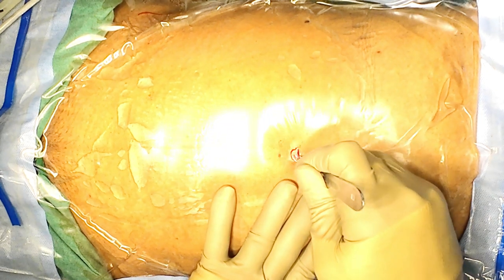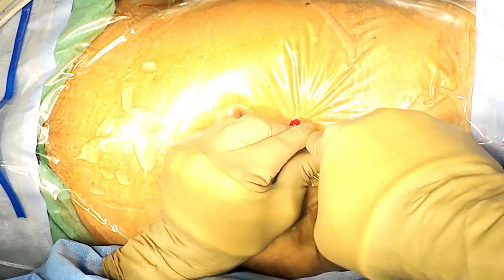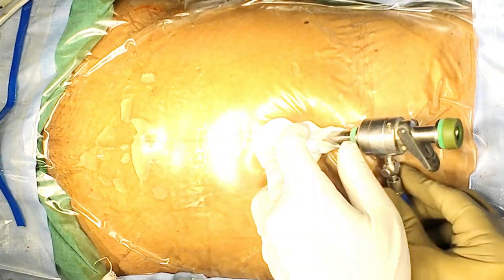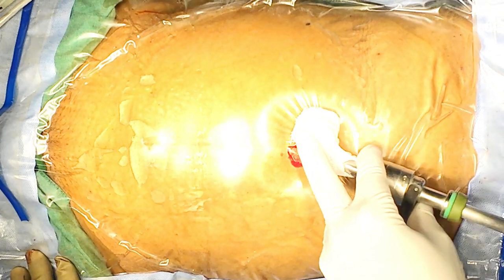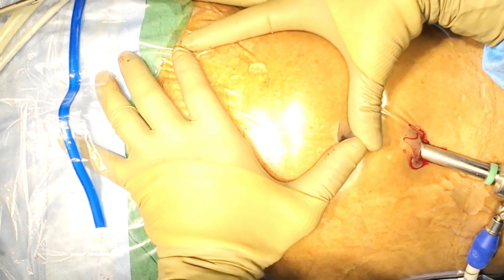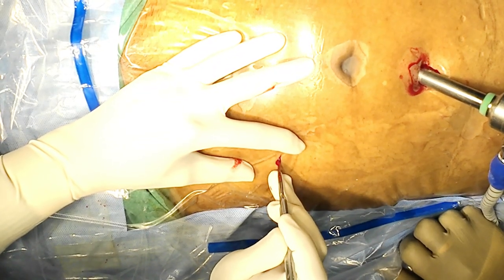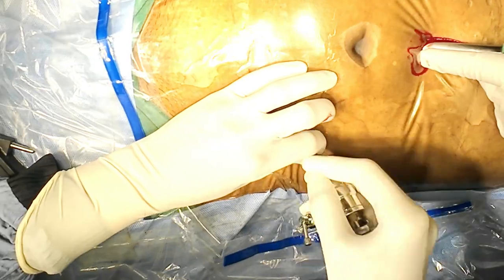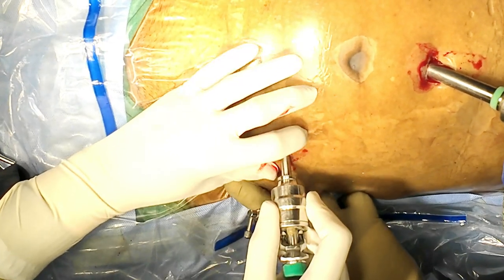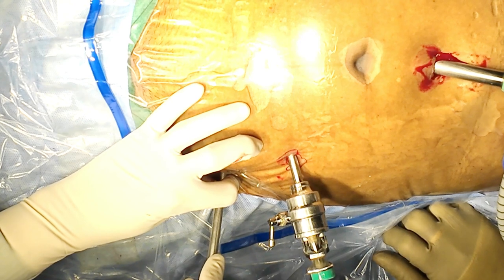The supraumbilical port is increased to 11 mm and the optical port is introduced, followed by the telescope. We will confirm transillumination. Using the baseball diamond concept — index finger over the target, thumb over the umbilicus — one port is placed at the snuff box and a second port 7.5 cm lateral and below. Two 5 mm working ports are introduced according to the baseball diamond concept.